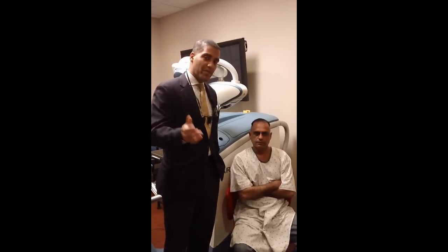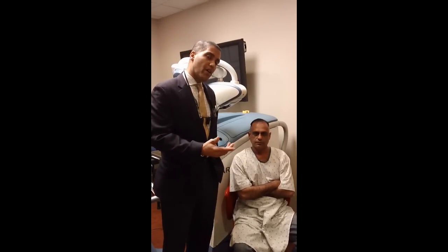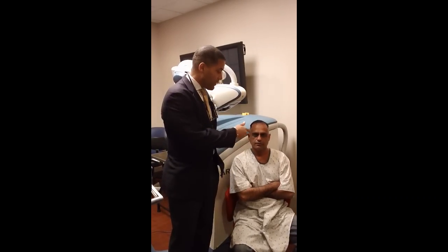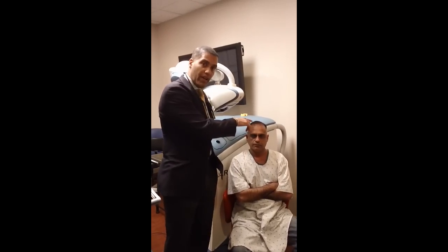Hello, this is Dr. Yates and this is my patient Ali. We just finished the ARTAS system today and we did about a thousand grafts, basically restructuring the hairline.